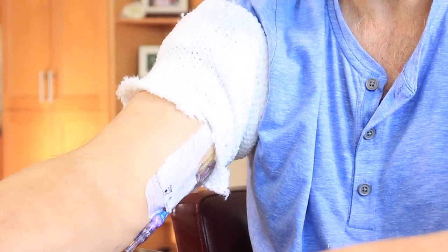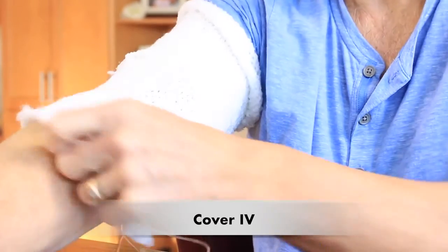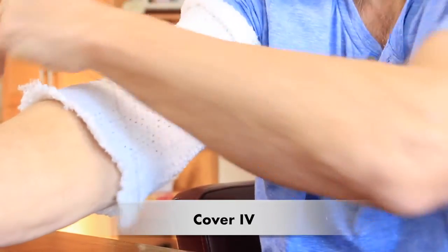If there was a clamp on your IV, you would pinch that clamp closed. We don't have one on this IV. Now you need to protect your IV. So you can see Scott is wrapping it up in this stocking. What some people do is they pull the stocking down a little and fold it over.